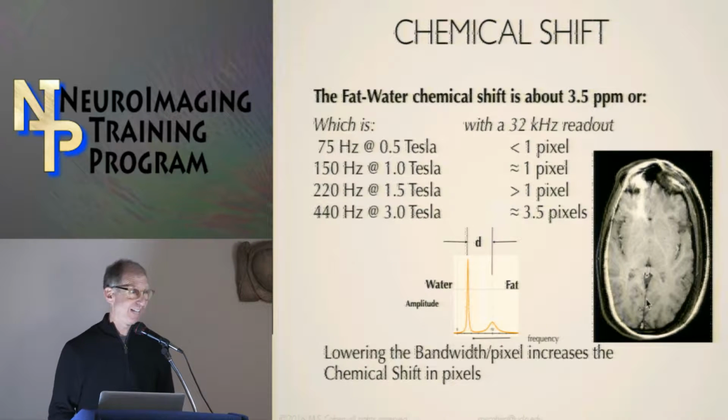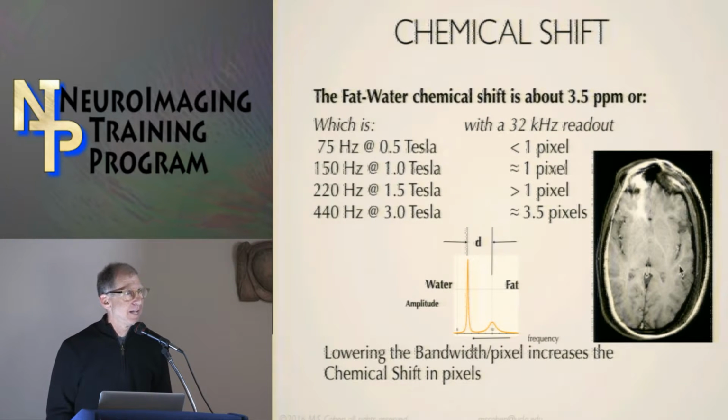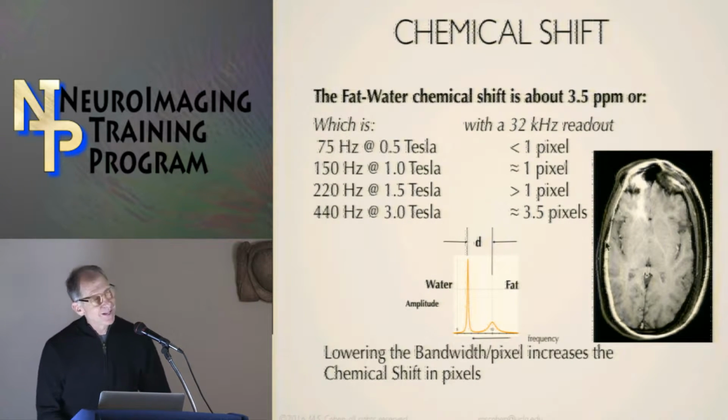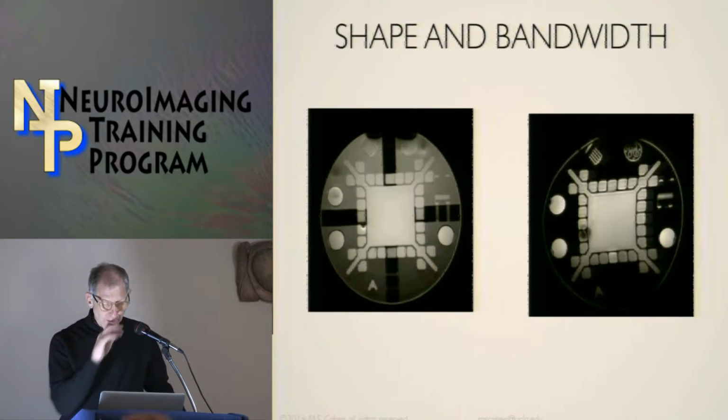What it actually does is save lives. Because the physicians, when they look at a brain scan, look at symmetry. And they can't help it. We all look at symmetry. And if you have a chemical shift artifact like this, and you're not paying attention, you might turn around and say, there's this ugly looking signal over here on the subject's left, your right, which isn't there on the other side. And the physicians were calling these hematomas, secondary to contusions. People came in with a head injury, they saw what looked like blood to them, and did the obvious thing, which is to break the skull open and try and get it out. Okay? Which is now why we run the frequency encoding axis the other direction.